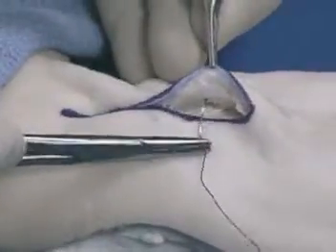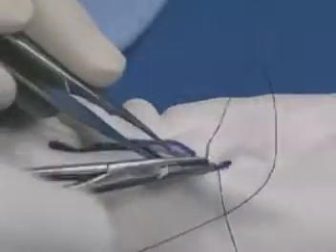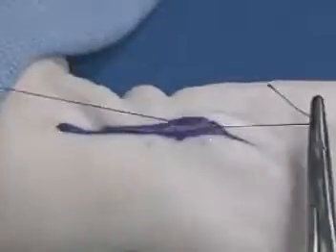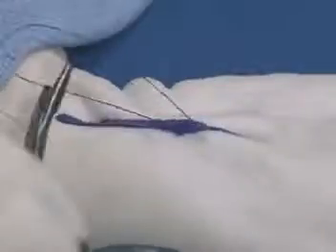A second deep suture is placed according to the principles of halving, midway between the first central suture and the end of the long axis of the wound. Again, an instrument tie is used to fashion the square knot. 4 throws are used to be sure that the knot is secure.